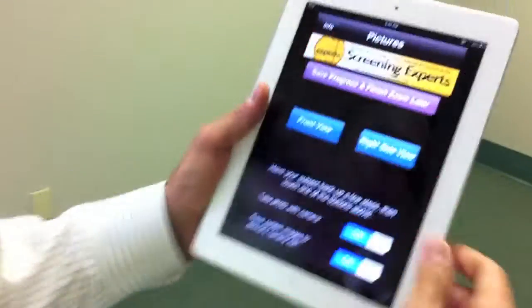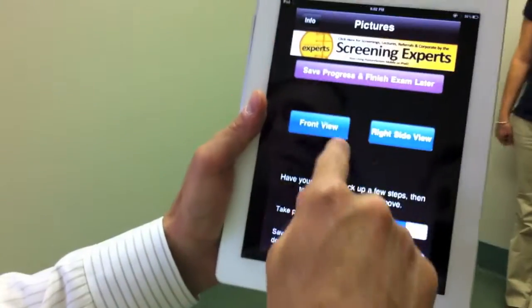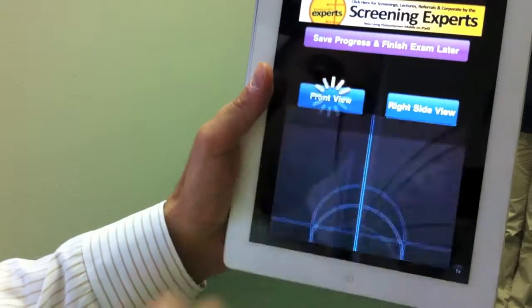So what we're going to do is I'm going to come back over here — thank you Nicole for volunteering. I made her do this, not much of a volunteer, right? So what we're going to do is we're going to hit front view.